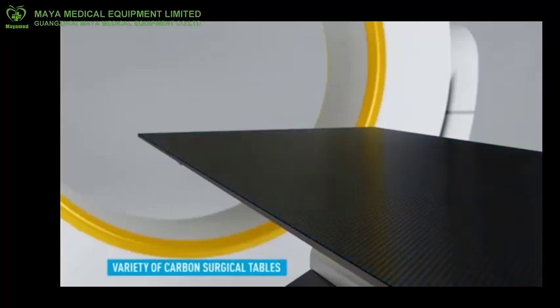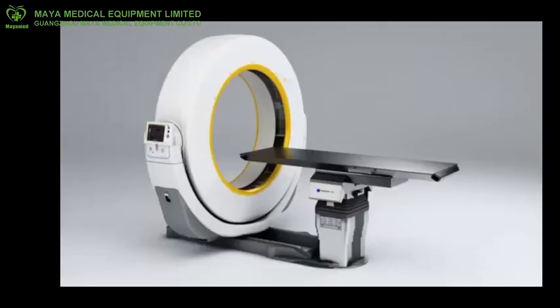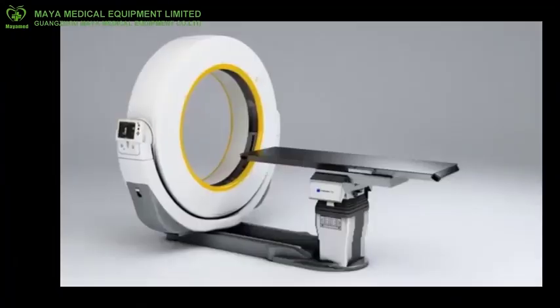The gantry also includes a laser light that is used to position the patient within the scanner. Control panels located on either side of the gantry opening allow the radiologic technologist to control the alignment lights, gantry tilt, and movement of the table. In most scanners, these functions may also be controlled via the operator's console. A microphone is installed in the gantry to allow communication between the patient and the radiologic technologist throughout the scanning procedure.